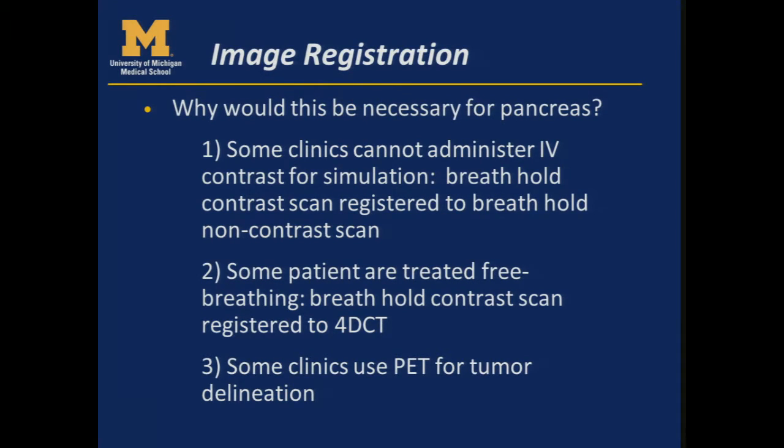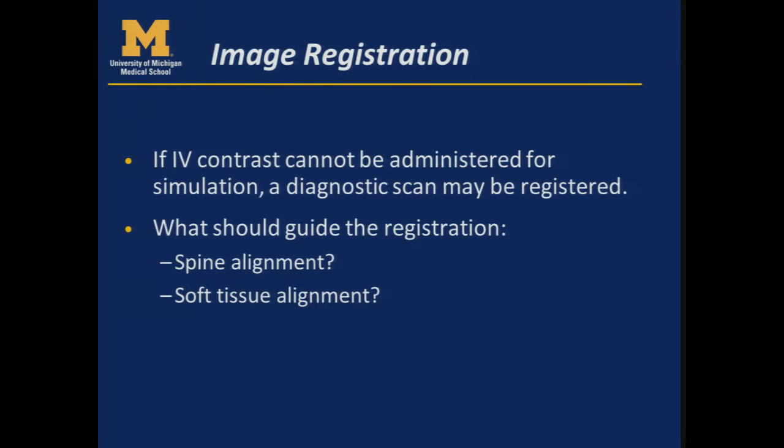So many clinics can't administer IV contrast, which means that they need to have a breath hold scan done in radiology with IV contrast to be registered to a non-contrast breath hold scan done in radiation oncology, and we'll go over how that will work. Some patients are treated free breathing, and we need a breath hold contrast scan, though, in order to see the tumor. So then many patients have a registration of a 4D CT to a breath hold exhale contrast enhanced scan. And then some clinics are using PET to help with tumor delineation as well, so fusing that data set with a breath hold contrast enhanced scan is challenging.